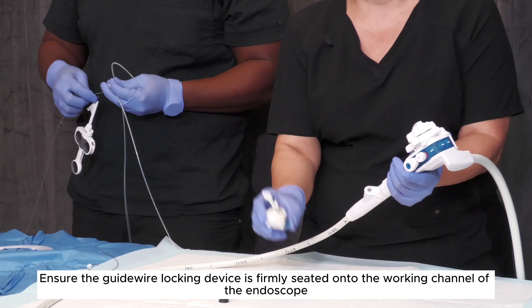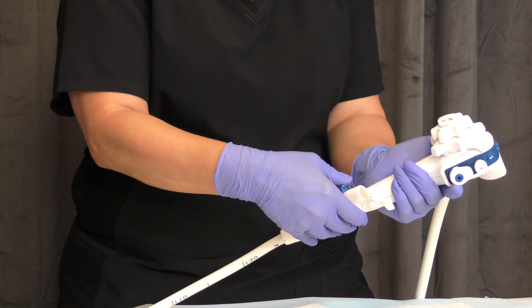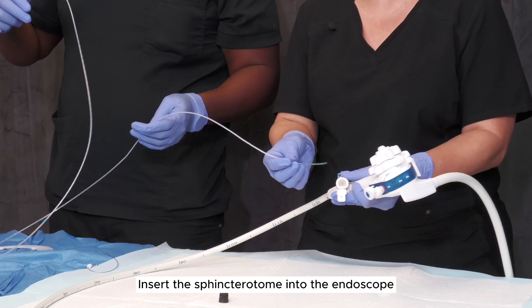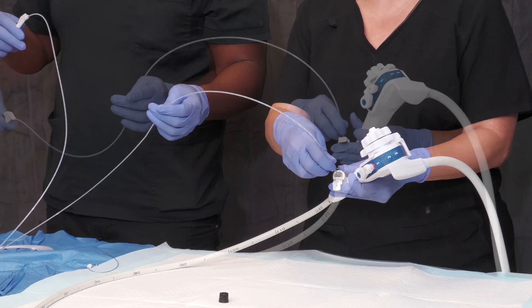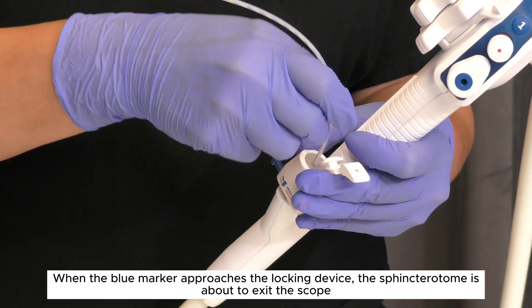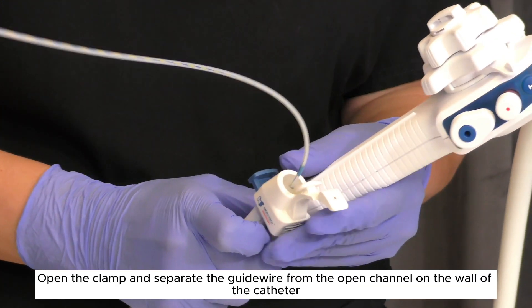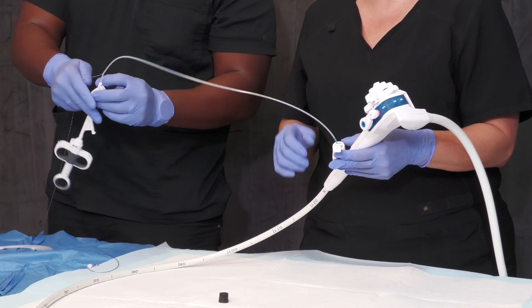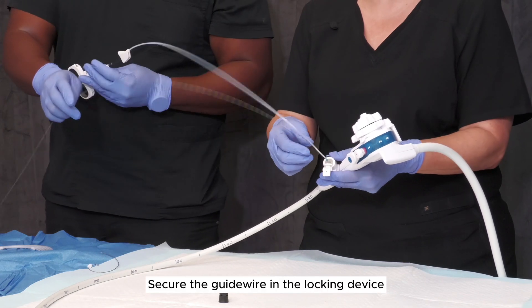Ensure the guide wire locking device is firmly seated onto the working channel of the endoscope. Insert the sphincteratome into the endoscope. When the blue marker approaches the locking device, the sphincteratome is about to exit the scope. Open the clamp and separate the guide wire from the open channel on the wall of the catheter. Secure the guide wire in the locking device.